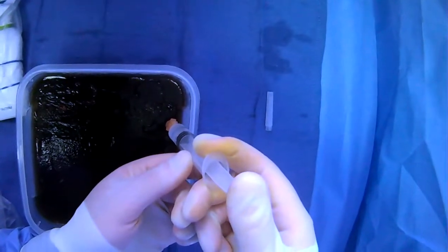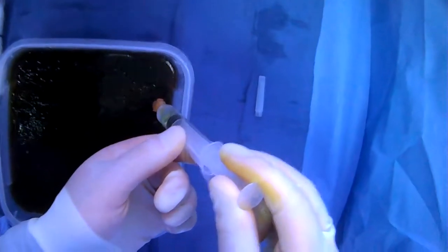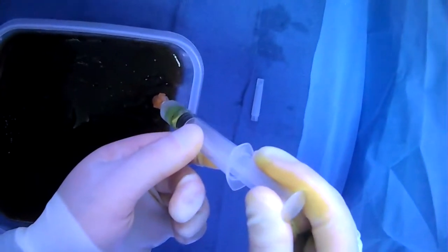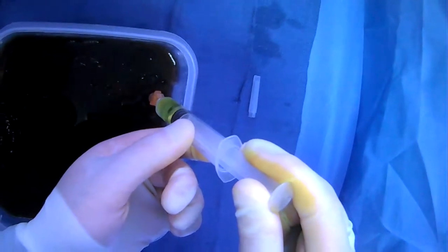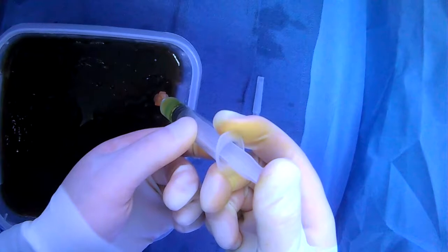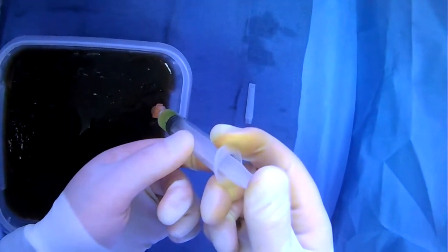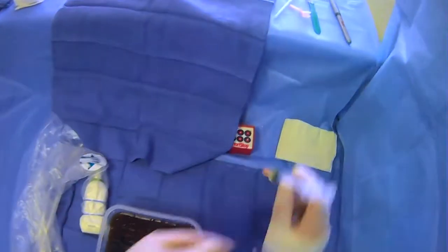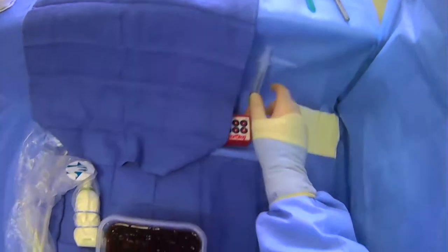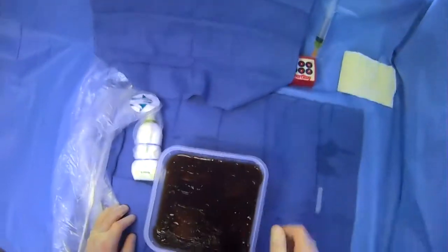Still nothing there. We're going to keep going deeper, periodically aspirating, and we see right here we're getting ascites back. So we're going to numb up very liberally in this area, kind of numb up that peritoneum, and then we're going to numb on the way out. Just as we suspected, we buried our sharp at about the two to three centimeter range and got into the ascites, and we've numbed up that tract.